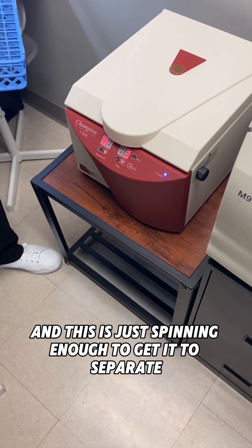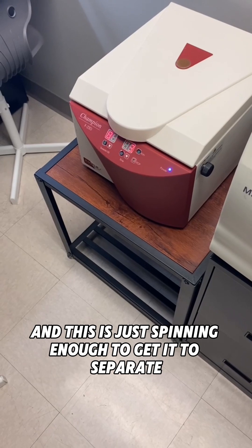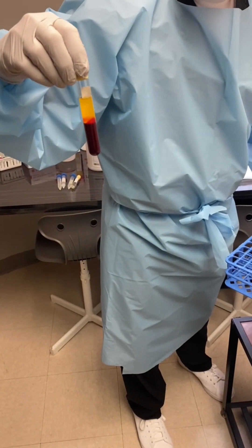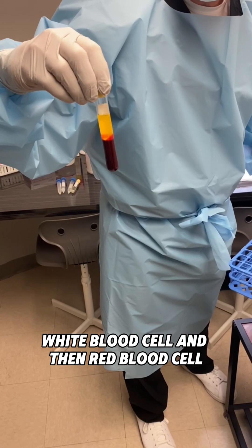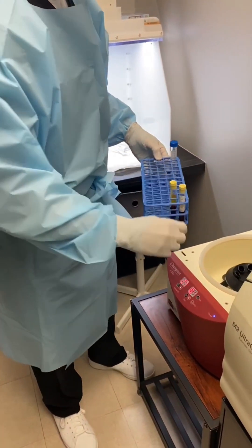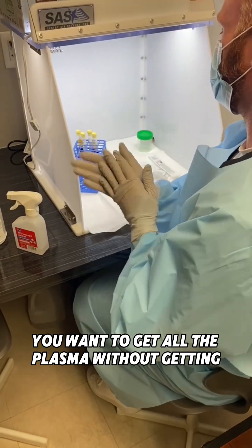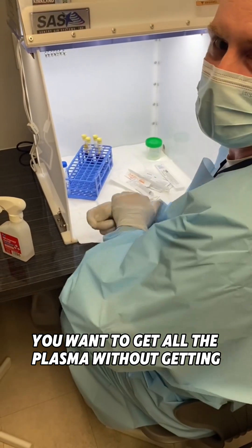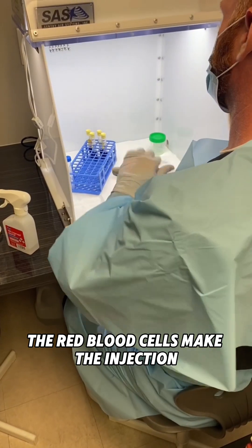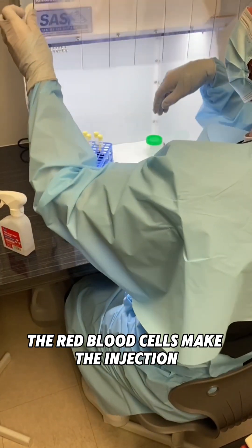That's after the first spin. You can see the plasma, white blood cells, and then red blood cells. You want to get all the plasma without getting red blood cells.